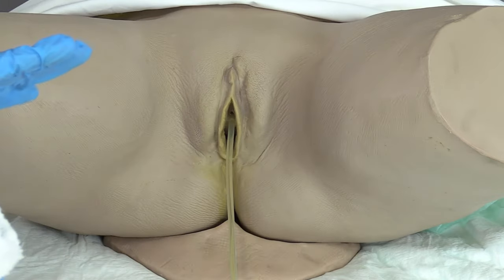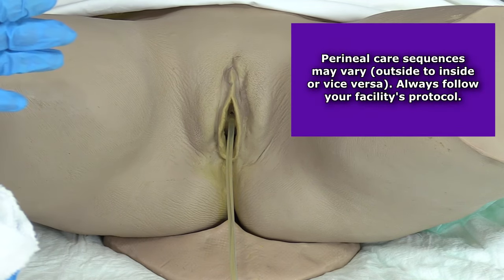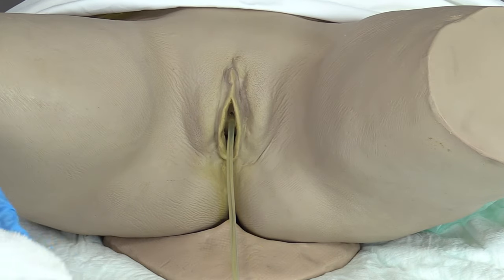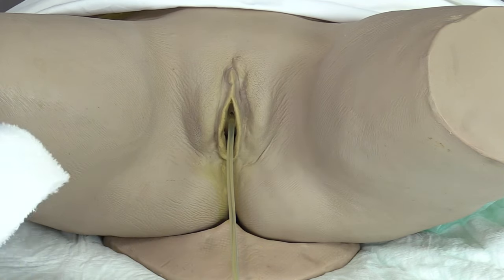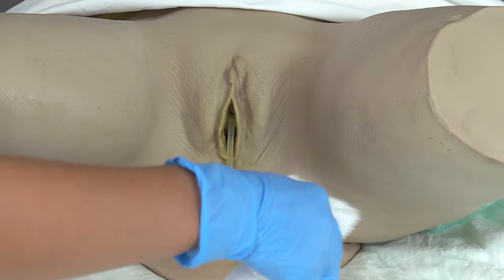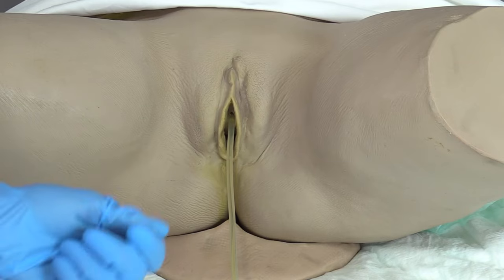So what I'm going to do is start with the cleanest areas and work to the dirtiest areas. So we're going to start on those inner thighs, and we're going to go from top to bottom. And another thing you want to remember is that whenever you are providing Peri-Care with a patient who has a catheter, you don't want to be tugging and pulling on this catheter. Sometimes it's inevitable you're going to brush up against the catheter. That is okay, as long as you're not tugging and pulling on it.